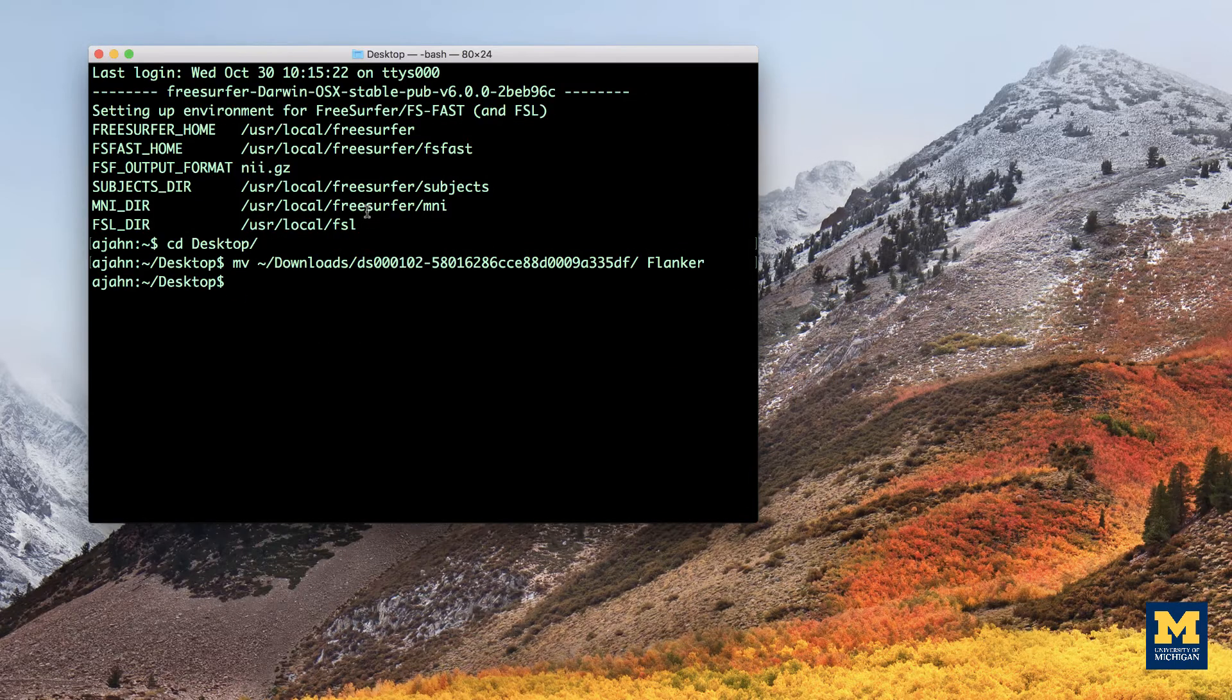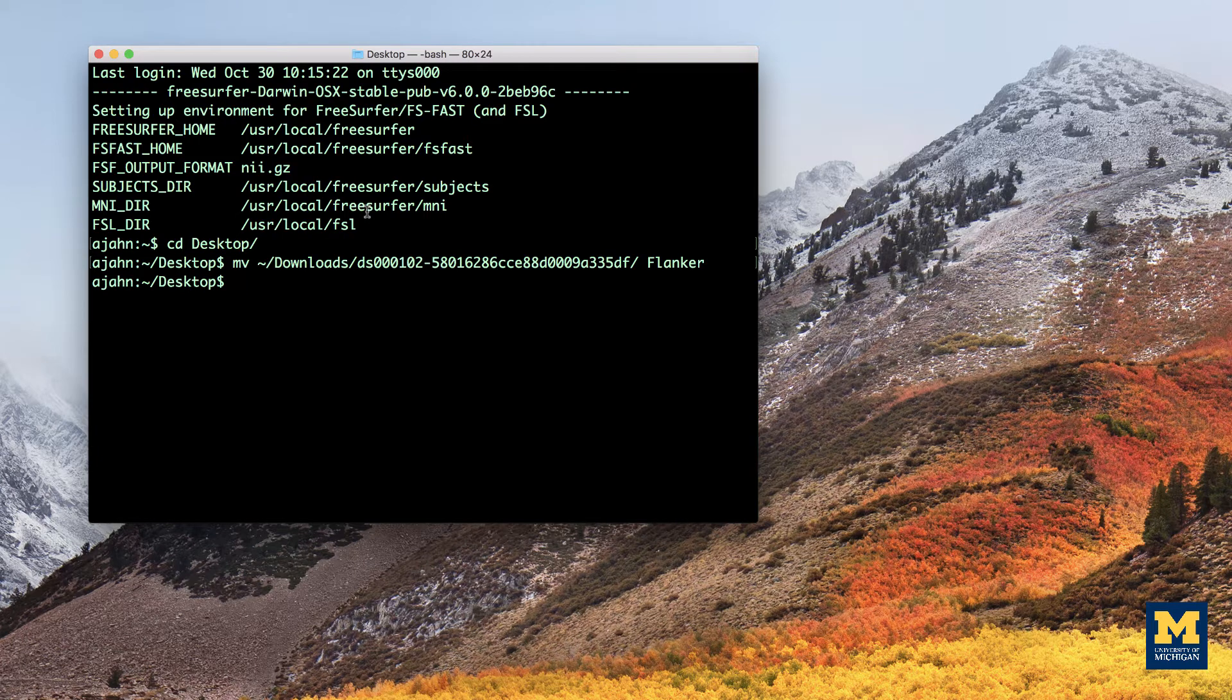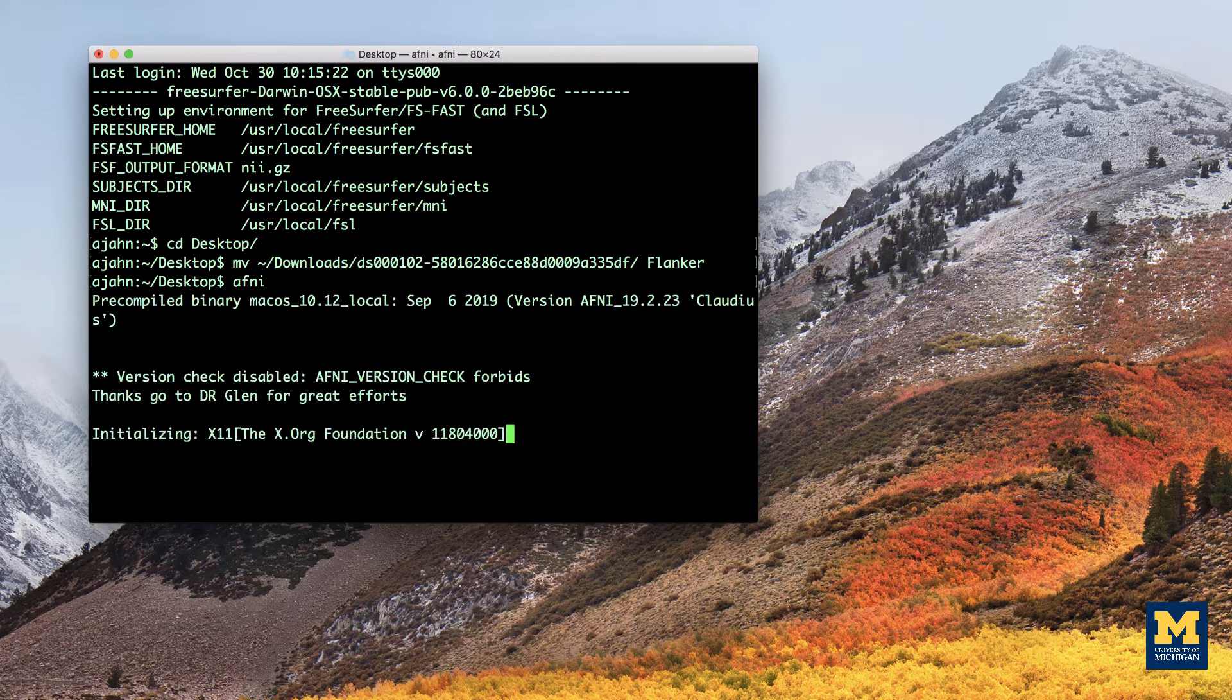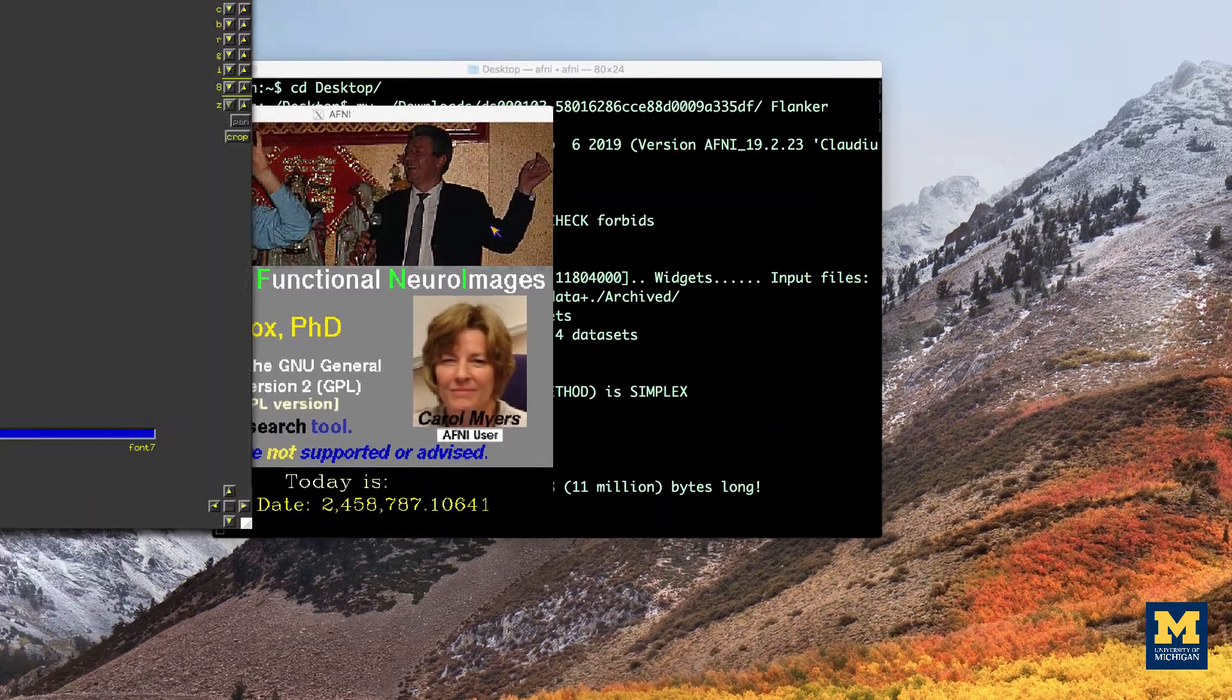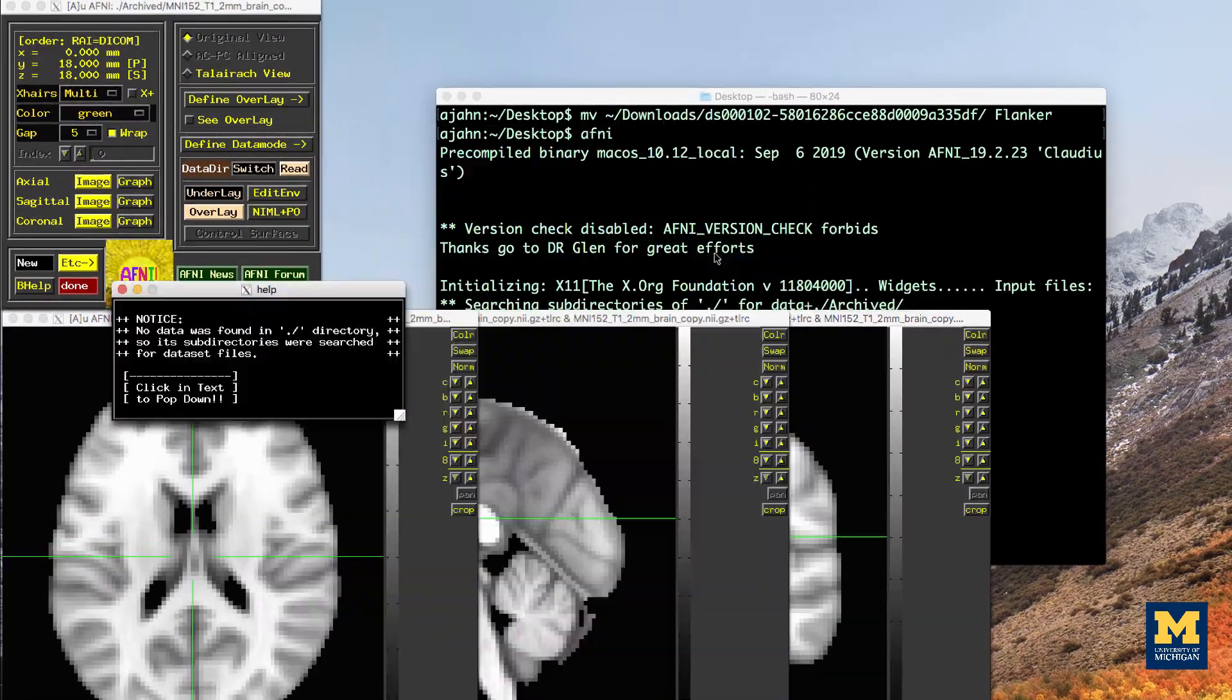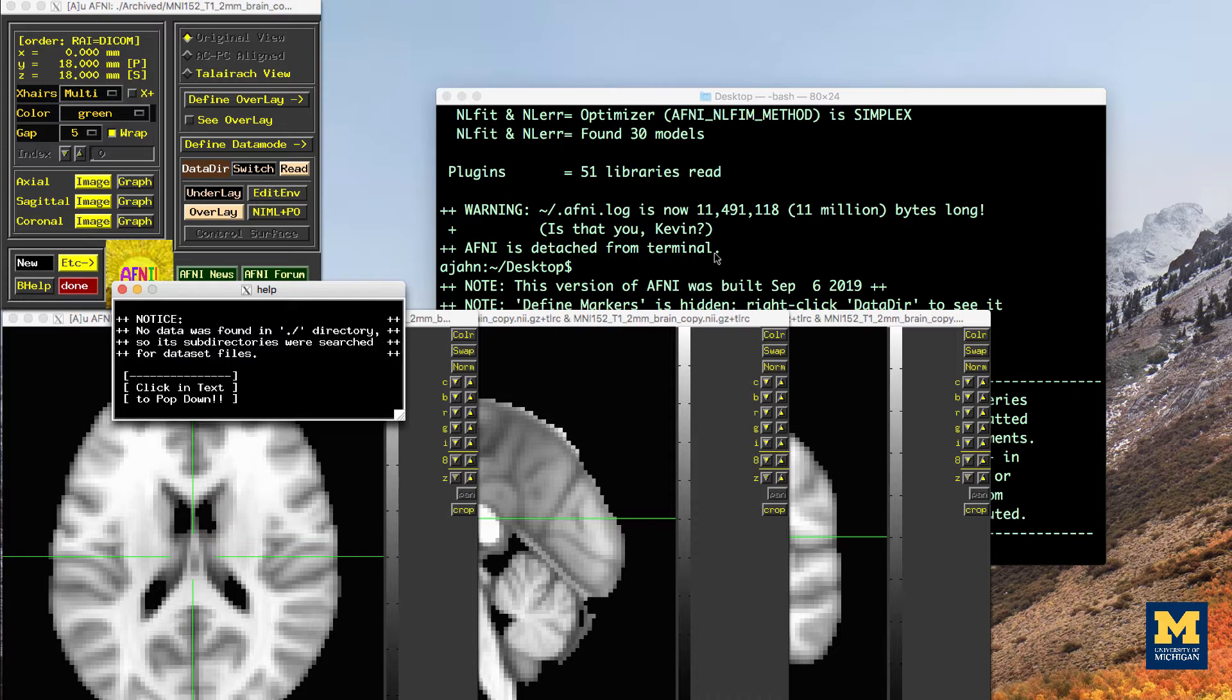To look at the data, we will be using the AFNI graphical user interface, or GUI for short. You can open the GUI by opening a terminal and then typing AFNI from the command line and pressing enter. This will open a controller window and three viewing windows. If there are no data in the current directory, a dummy data set will be loaded.